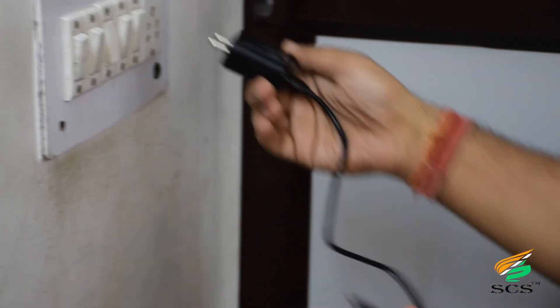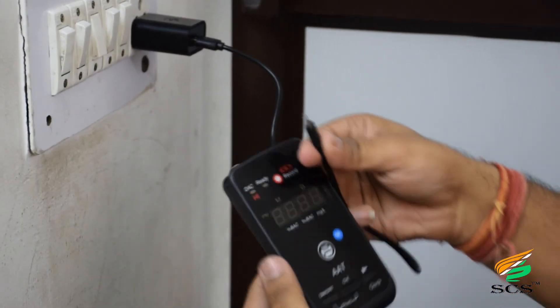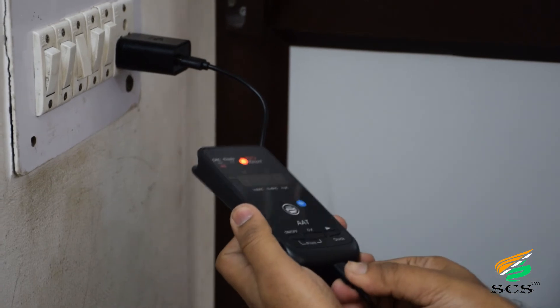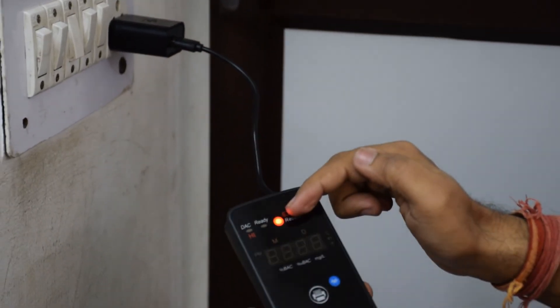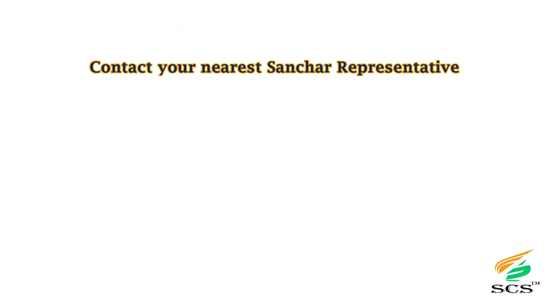This is the charging adapter. When we connect the charger to the device, a red color light indication shows on the device. For further assistance, contact your nearest Sanchar representative and follow us on social media.